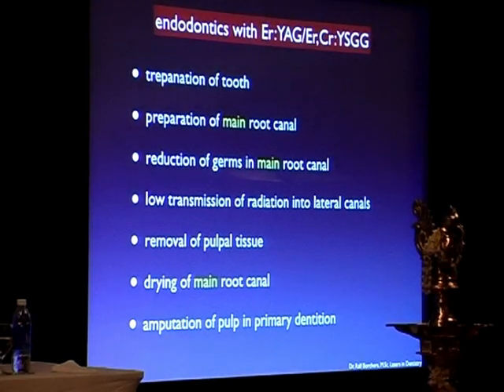Endodontics with the erbium and erbium chromium YSGG. Dr. Pradhan always said it with the PIP method. I do not mention the PIP method because you have seen it in his cases. Normally, you can only use the erbium YAG laser to treat the main canals.